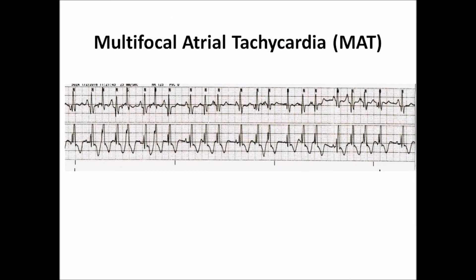Multifocal atrial tachycardia with a block. This is an irregularly irregular rhythm with several different P-wave morphologies and variable PR interval. The QRS is wide and the rate is about 120 to 130 beats per minute.